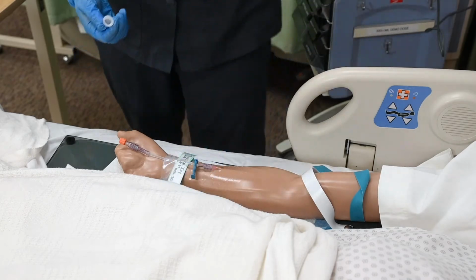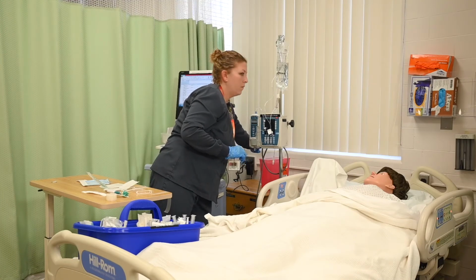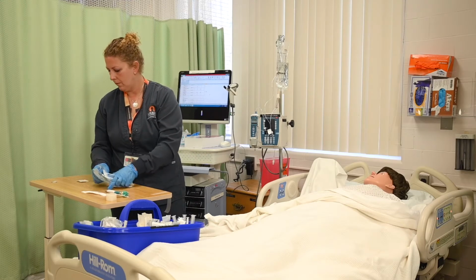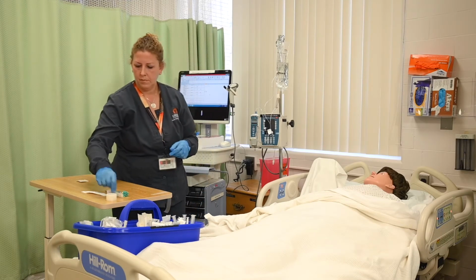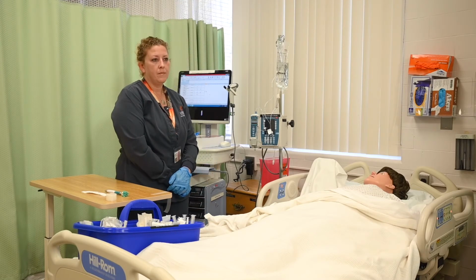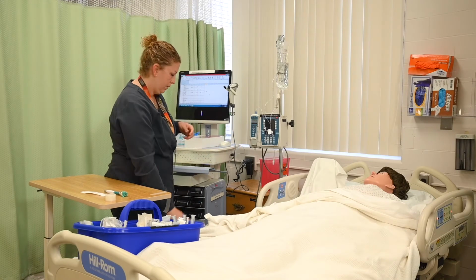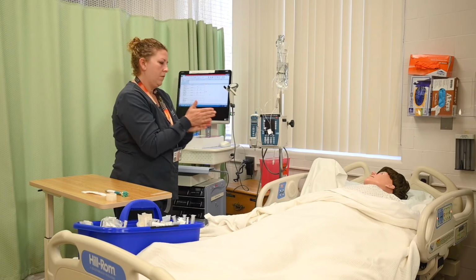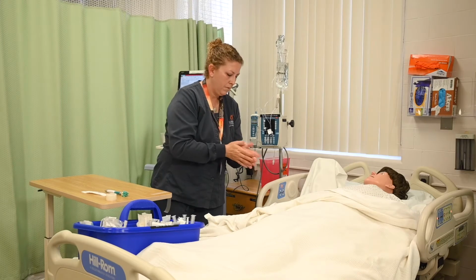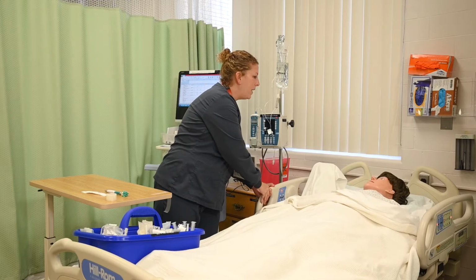Dispose of the needle in the sharps container. Discard used supplies and equipment. Remove gloves and perform hand hygiene. Reposition the patient for comfort, placing call light within reach and leaving the patient safe. You have your call light. I'm going to put the bed back down.